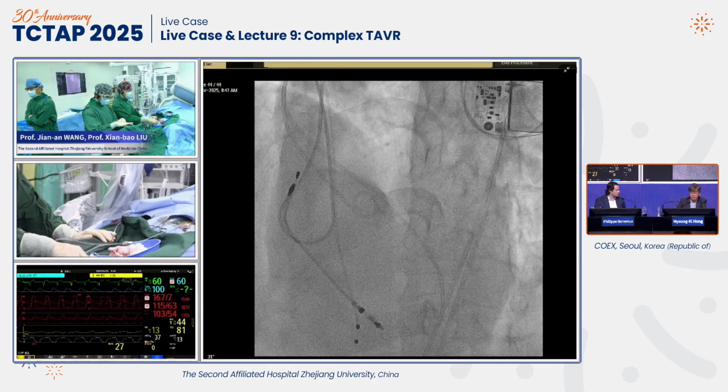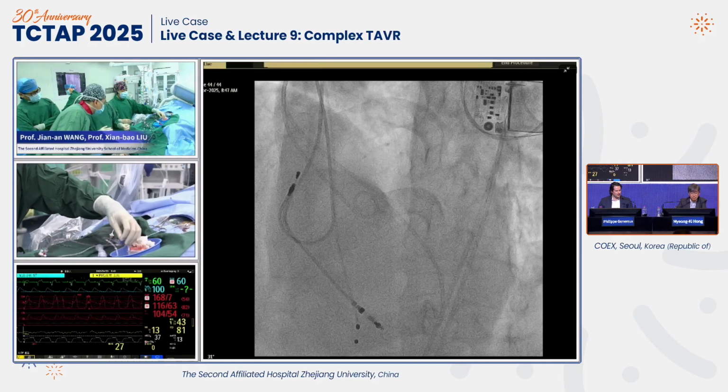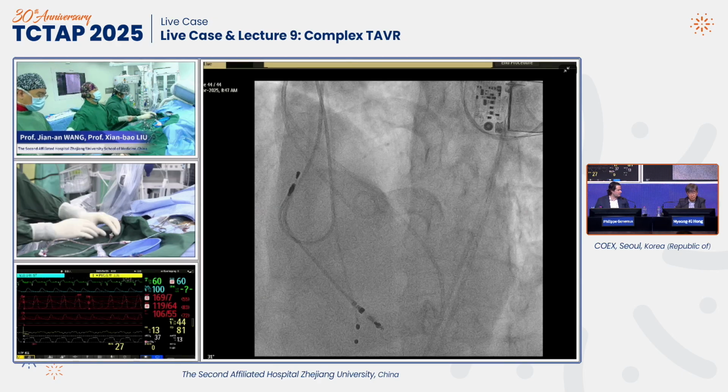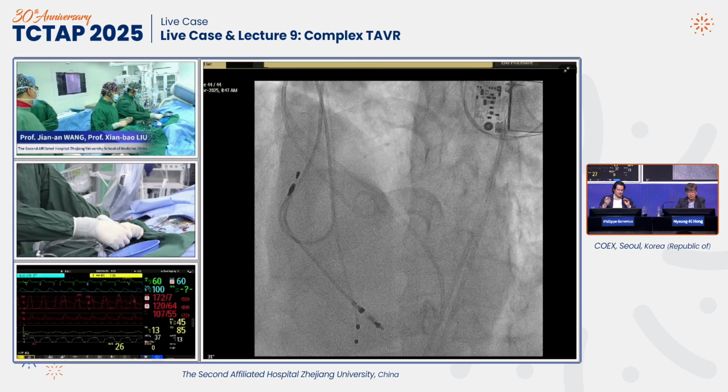We bring the controller and we use the permanent pacemaker. Sometimes we have to be careful because those permanent pacemakers have a threshold. Sometimes they cannot go above 160. Here you have a double chamber, so make sure you don't pace with the atrium. You need to make sure you pace with the ventricle. So sometimes I just put in LV pacing. I pace on the LV to make sure we have a good drop of blood pressure and pace above 180. But everything is possible.